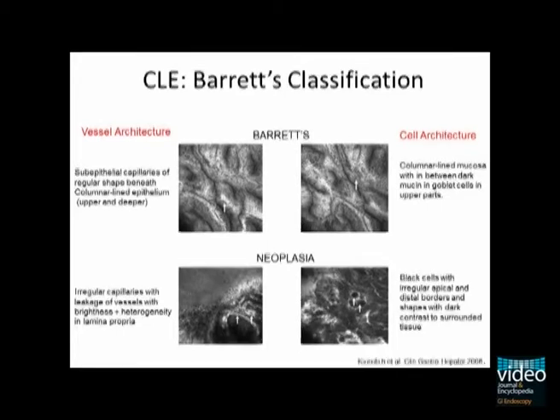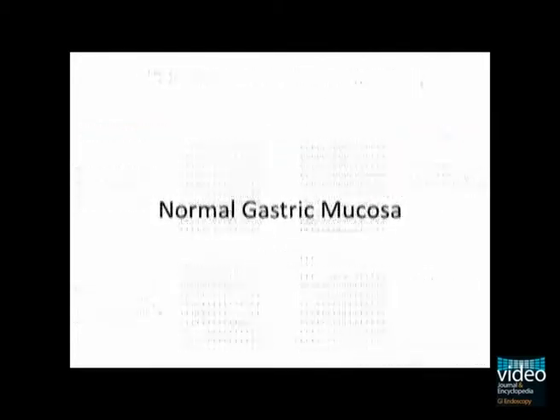This is normal gastric mucosa. Imaging is performed after injection of 10 percent fluorescein. Notice the small regular formation of gastric glands in a mosaic pattern. Also notice the cobblestone appearance of epithelial cells. The honeycombed pattern and cobblestone epithelium is apparent despite motion artifact. Notice the bright fluorescence between the cells secondary to fluorescence in the extracellular matrix.